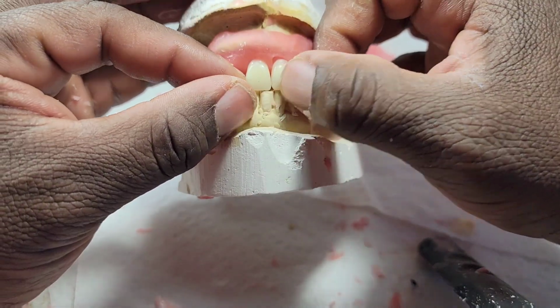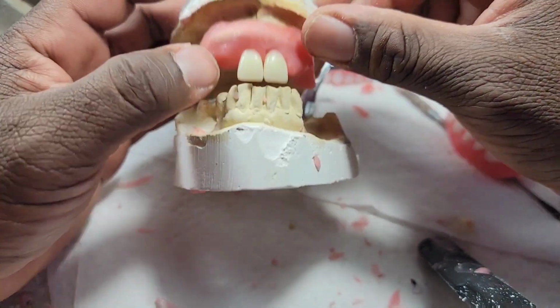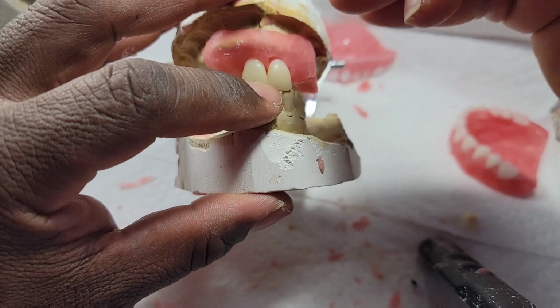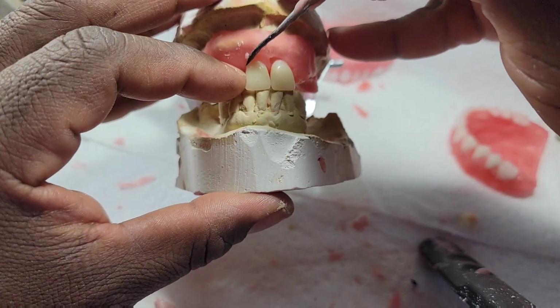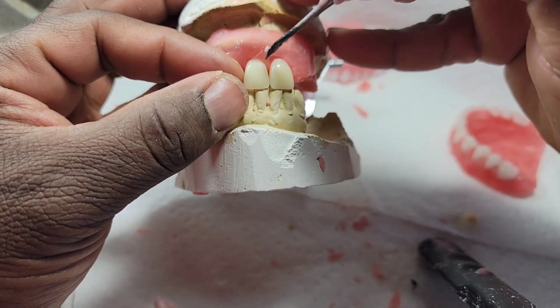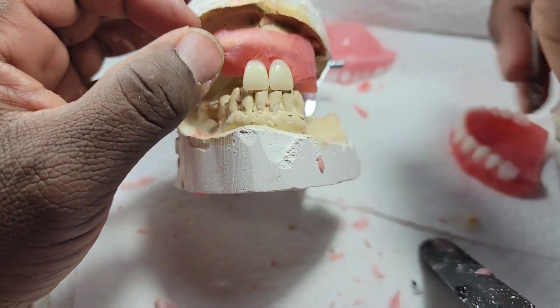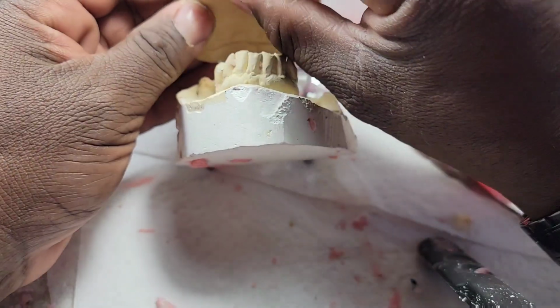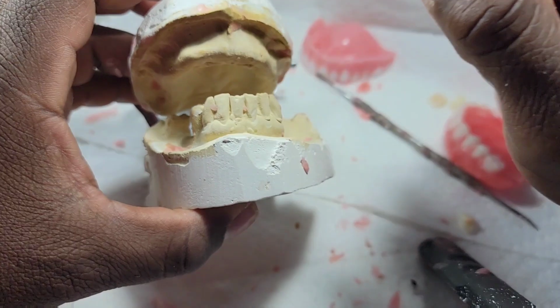So in order to get this going, I have to add so much wax in order to work around it. And then the person said, oh, my denture is so thick, I can't stand it, it's too thick. Okay, how much vertical was added to your denture? That's the vertical dimension and the distance between your condyles and your rest areas.